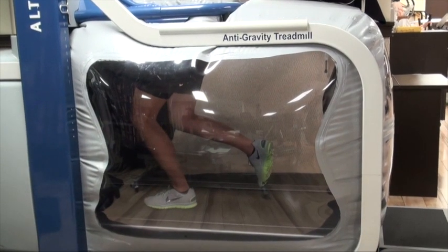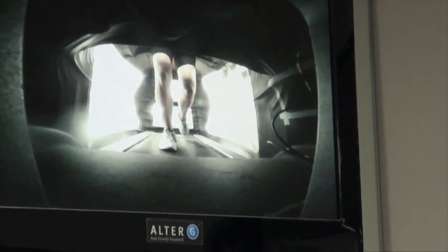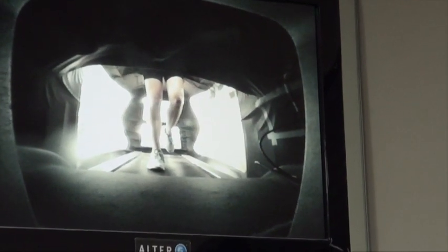With the treadmill stopped, the patient is able to perform exercises such as single leg squats, hip abduction, and balance activities while still unweighted.